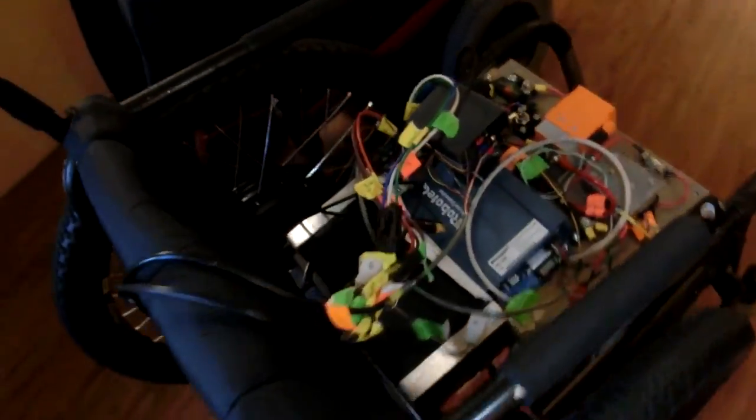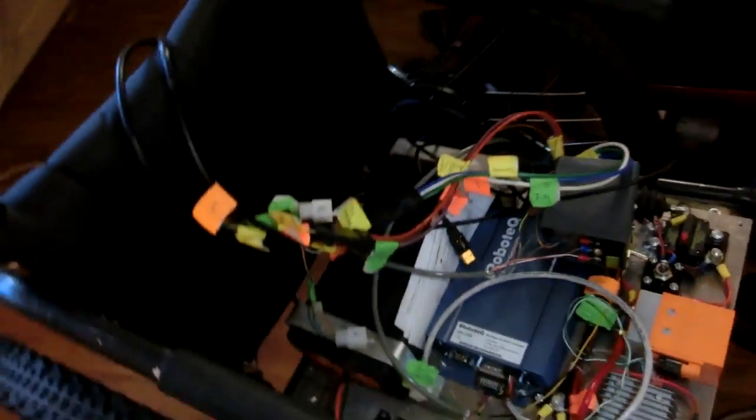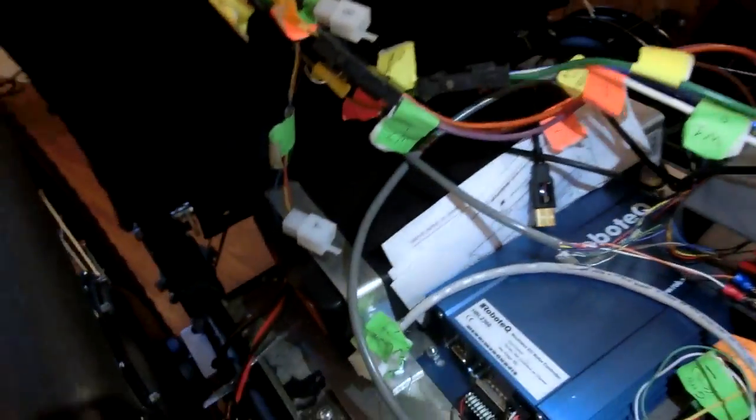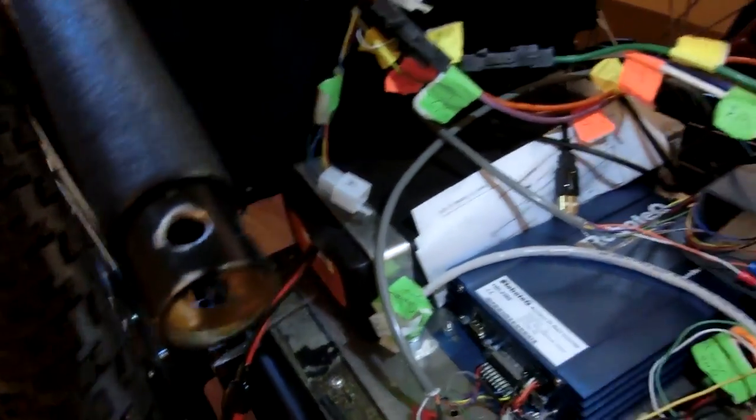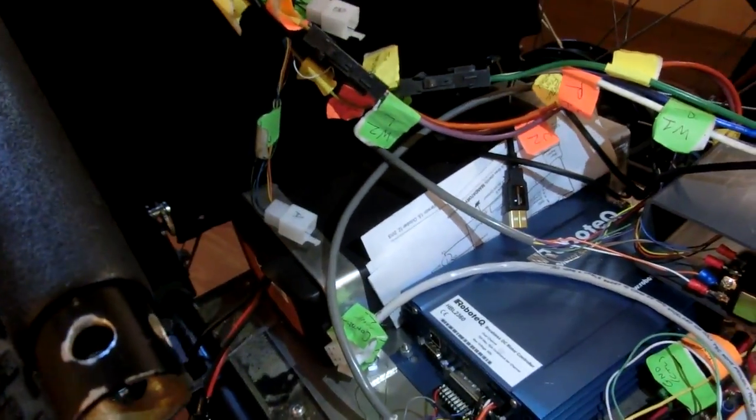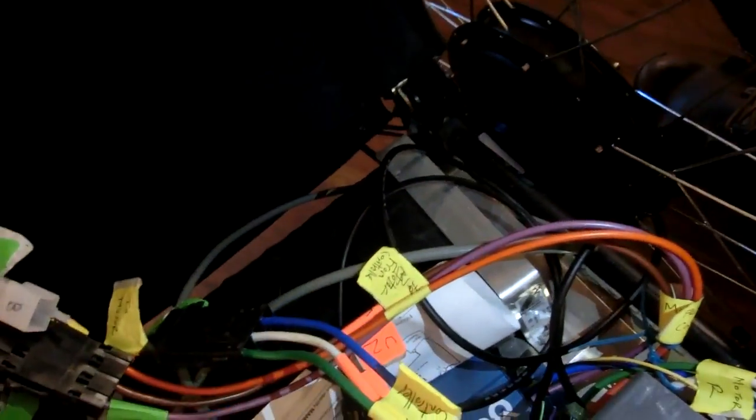Oh nice, LiFePO4 is a lot safer. Yeah and you get a lot more charge cycles. Oh so you switch to 48 volts too. Yeah 48 volt 10 amp hour.